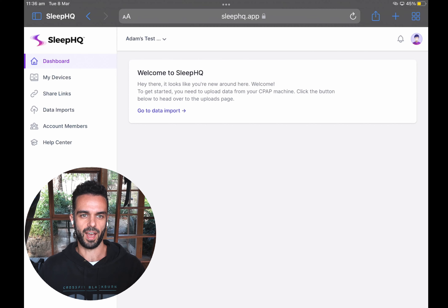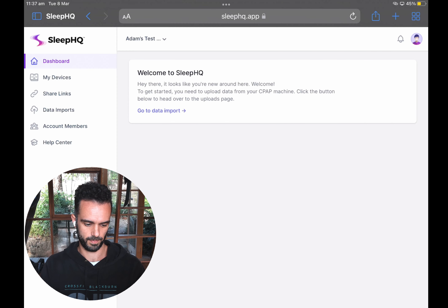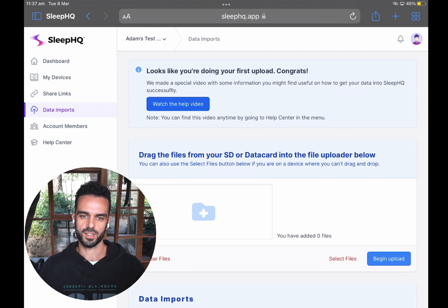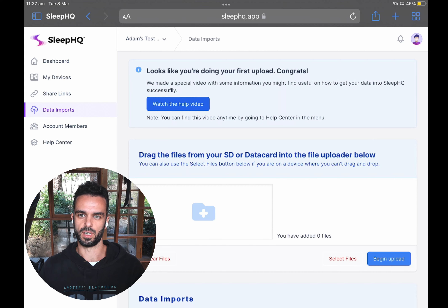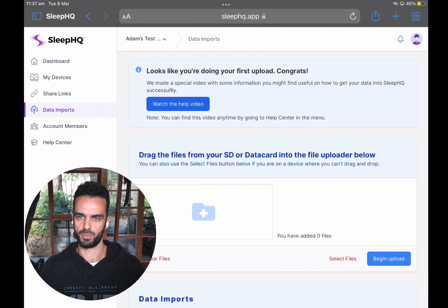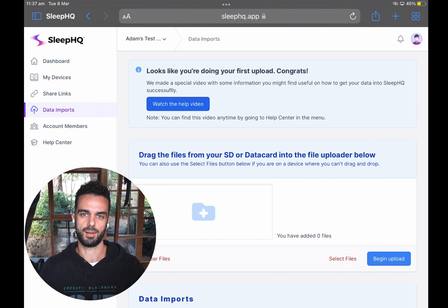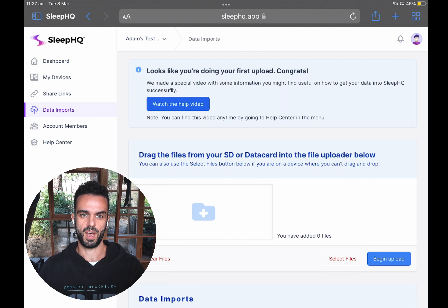I'm on my iPad now, I've created a new account on Sleep HQ and logged in. The first thing I'm going to do is click "Go to Data Import." Once I'm on the data import page, I need to find the files I'm going to be uploading. I've connected my SD card to my iPad using an SD card reader — you can buy one from Amazon or many places online. Once connected, it should show up in your Files app, so I'm going to get the Files app on screen alongside my browser.